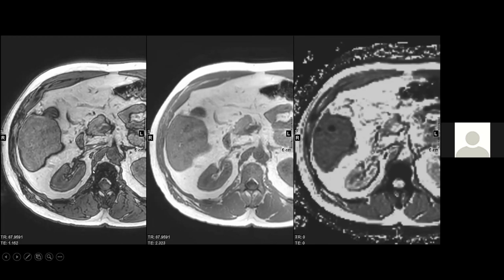And it would become an issue, right? Because iron loses signal, so there's signal loss on whichever set of images is acquired as a second echo. Because TE is prolonged and you have more time to see the T2 star effect take place. The fat always gets dropped on the out of phase images regardless of whether you acquire it as first echo or second echo. Does that make sense?